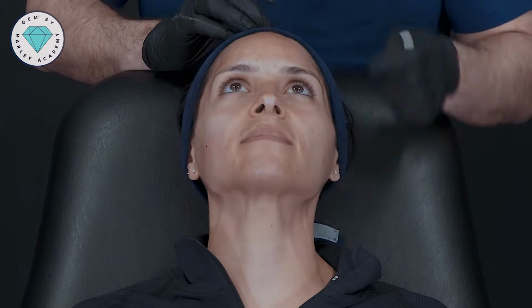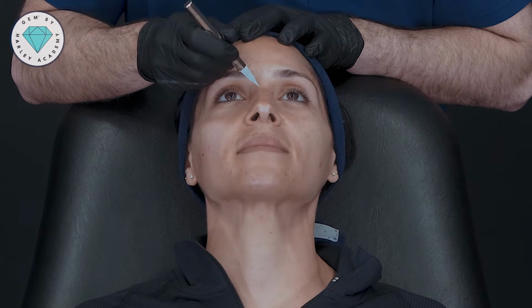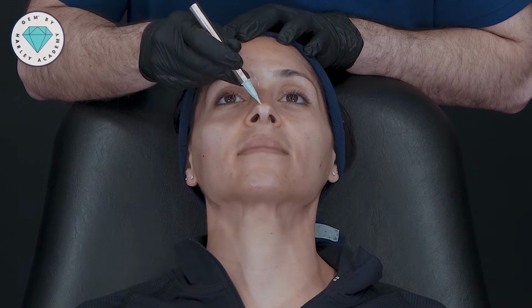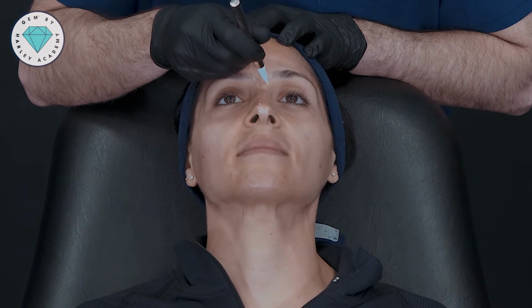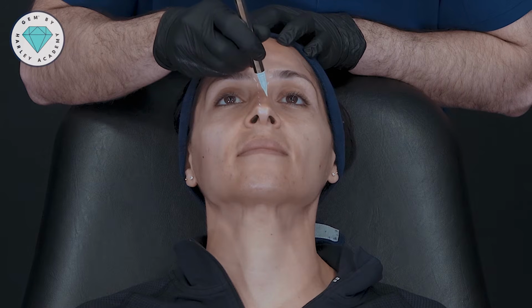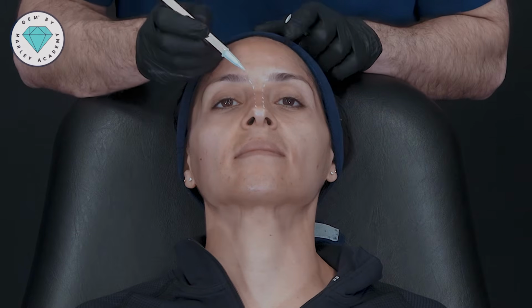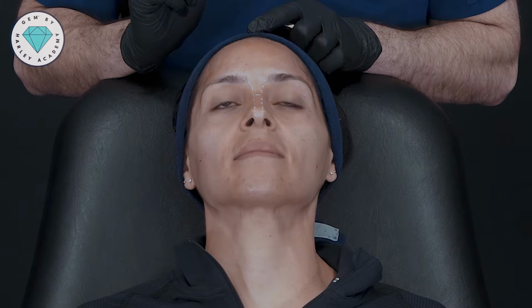As always, because we're doing a midline structure, I'm going to stand at the top. And I'm going to start off by drawing my aesthetic lines that go all the way from the brow down to the tip of the nose. This tells me where I want the projection of the nose to live between, and it also helps me to identify any areas where we may have a little bit of irregularity. So I can see here we have the dorsal hump there.